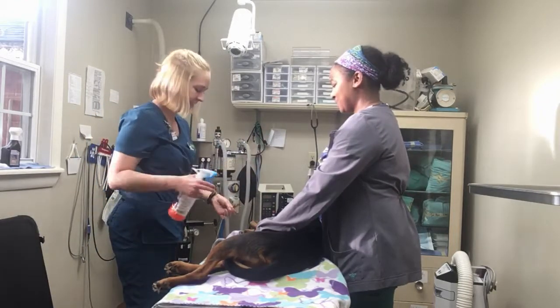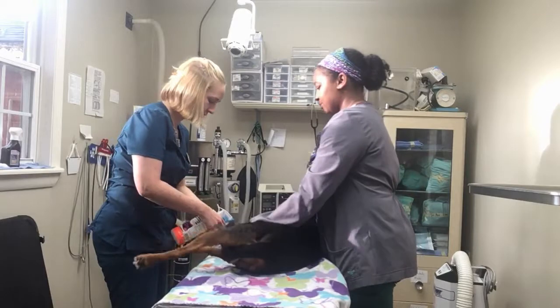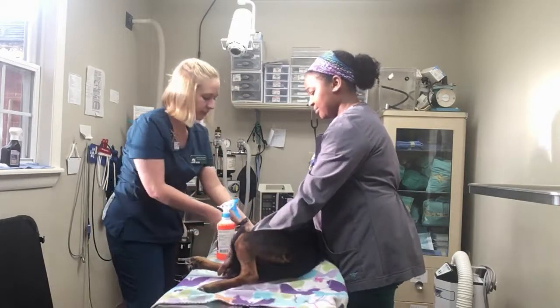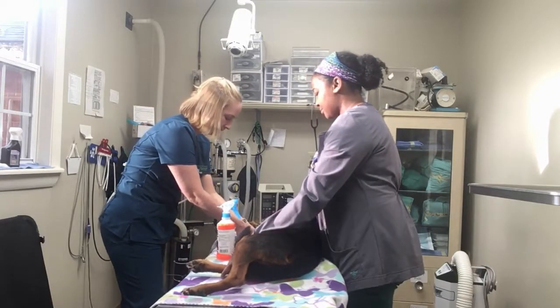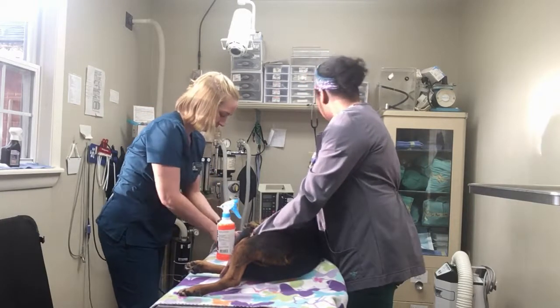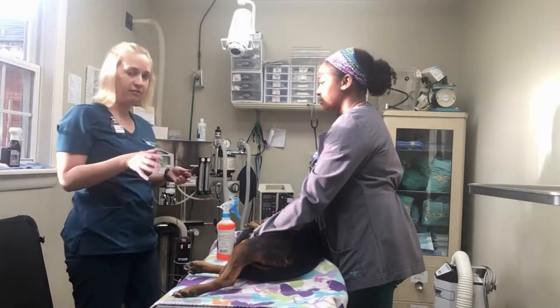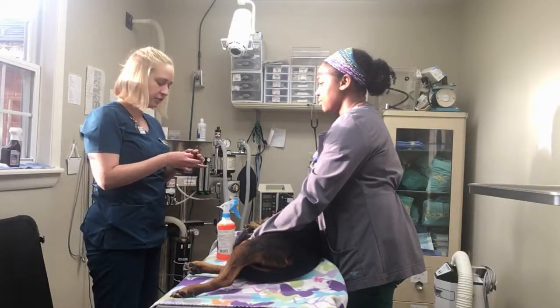I'm going to spray with some alcohol first. It's okay, bud. You're doing good. And you're going to place it right below the elbow. So this is a 3-lead system. Some of them do have 4 with a green lead, but this one has 3.